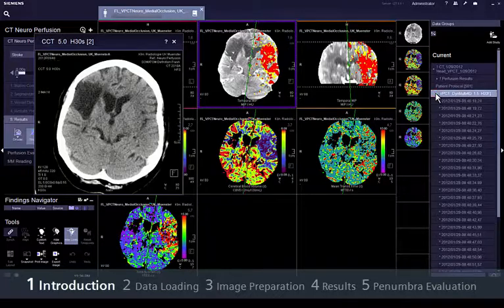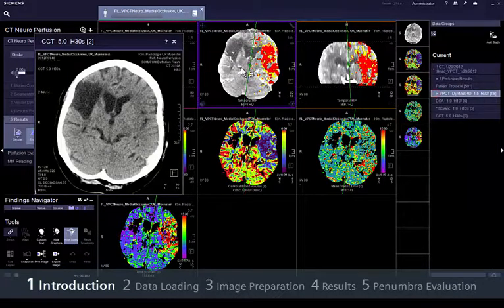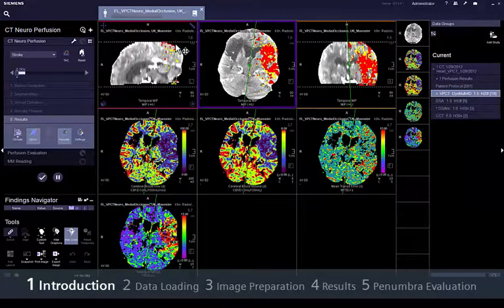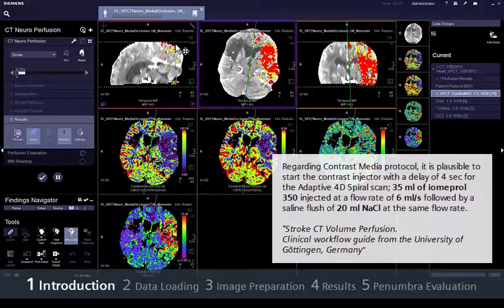The typical clinical procedure consists of a non-contrast CT head scan for exclusion of brain haemorrhages, followed by a dynamic examination performed for instance with an adaptive 4D spiral scan mode. Regarding contrast media protocol, it is plausible to start the contrast injector with a delay of 4 seconds for the adaptive 4D spiral scan.